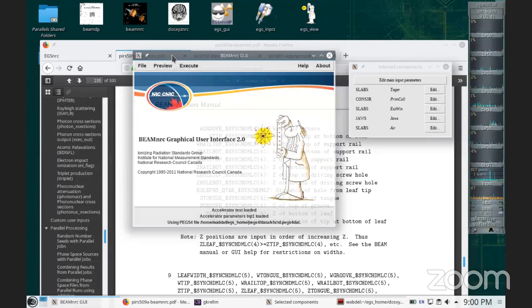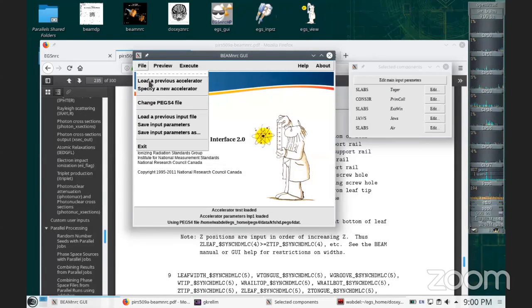One thing I really encourage you to do is try to get your beam model. For example, get the jaws, get your collimator, what's the material, what are the distances. A lot of information you need actually to start. Don't ask me, I don't know this information. You need to get that information. Probably some other people will share this with you, but that is what you will need.